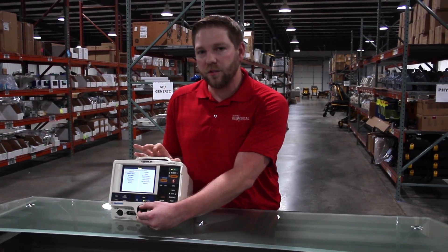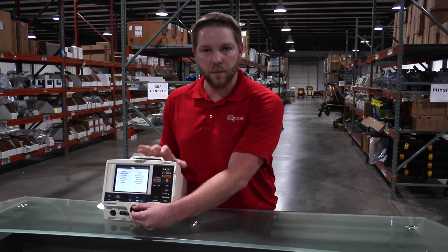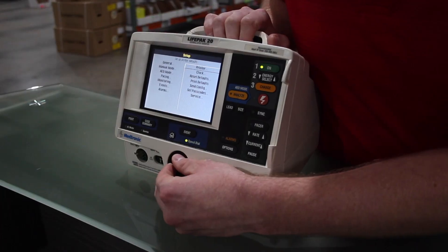Once that's done, if you had to change your time and date, please power cycle your unit and turn it back on in service mode to complete the save. Once you're back in, scroll down to service.